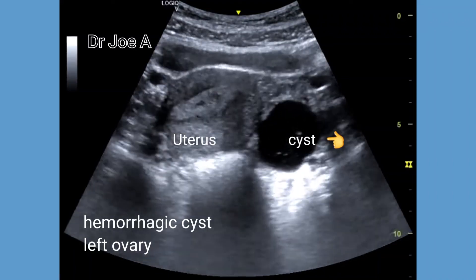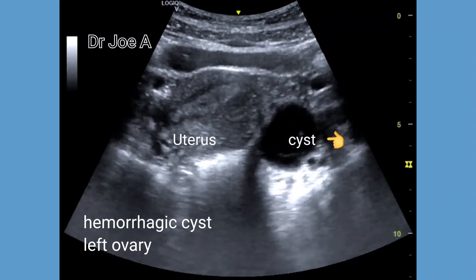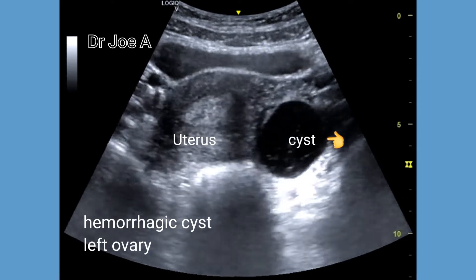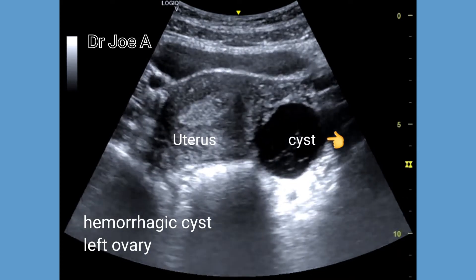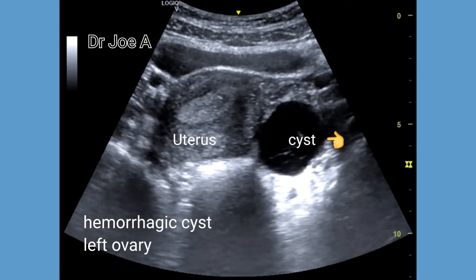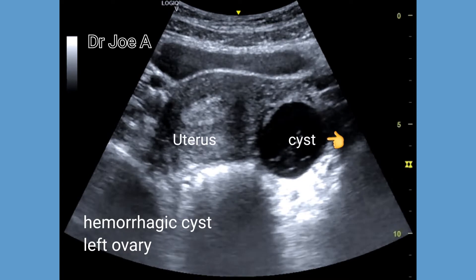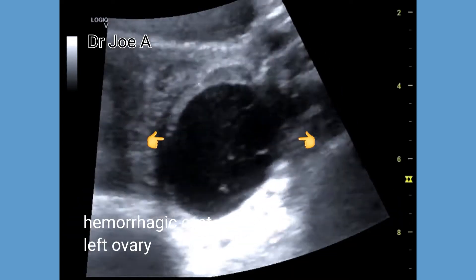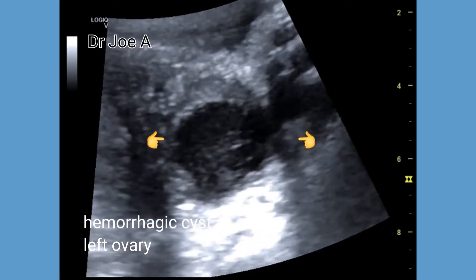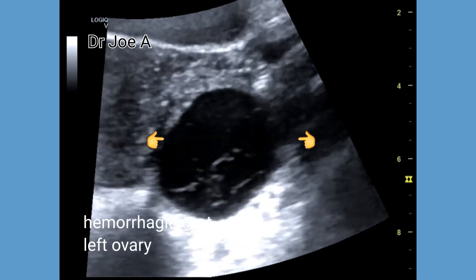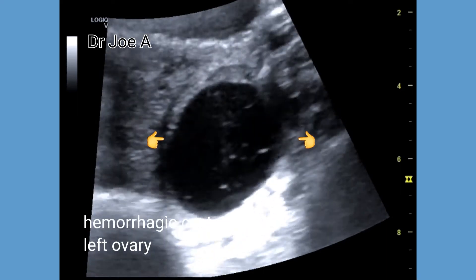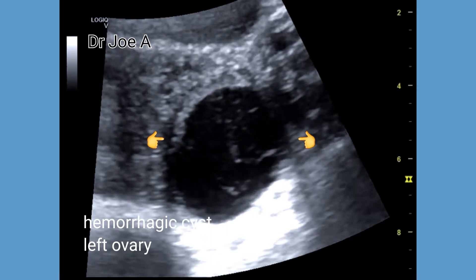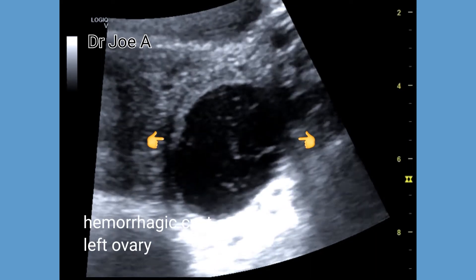This patient shows a hemorrhagic cyst of the ovary. Hemorrhagic cysts are formed most commonly by bleeding or hemorrhage into the corpus luteum following ovulation. Ultrasound shows a cyst with a lace-like or reticular pattern within the cyst.